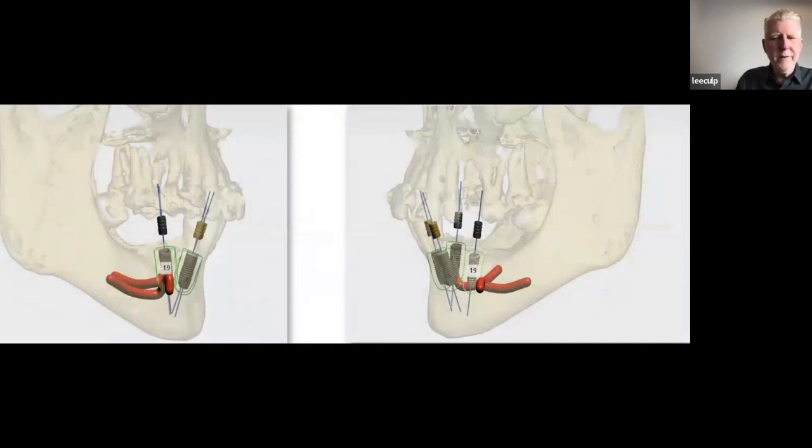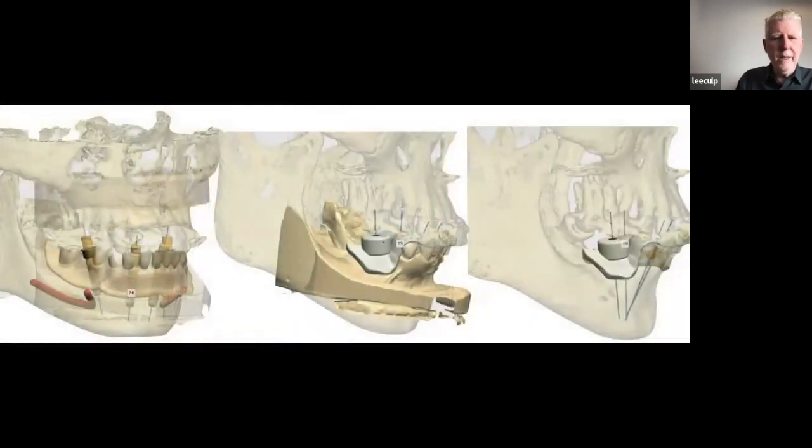And then our final design for the implants. So we're doing kind of a modification of what John was just talking about. We're going to keep teeth, so this will be a tissue-borne, tooth-borne implant guide. We're going to extract the teeth where the implants are going, leave the rest of the teeth for the guide to sit on, and then we're also sitting on tissue.